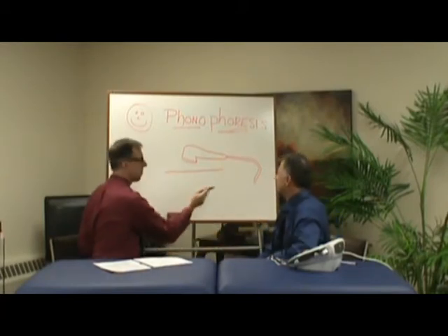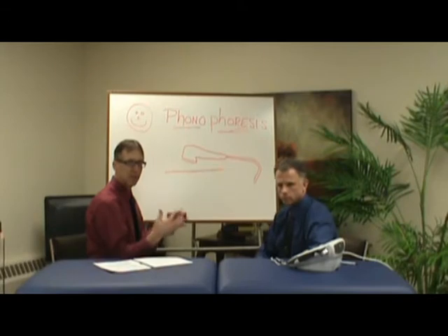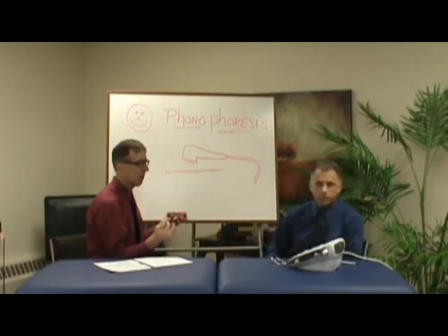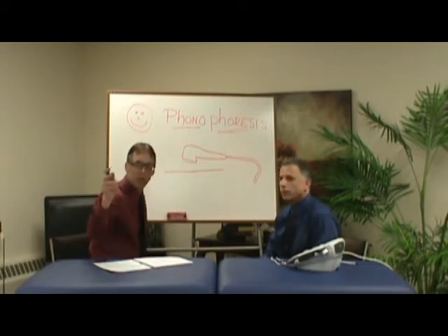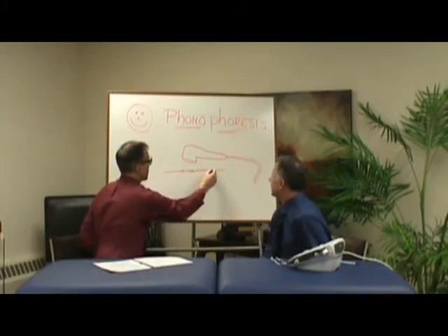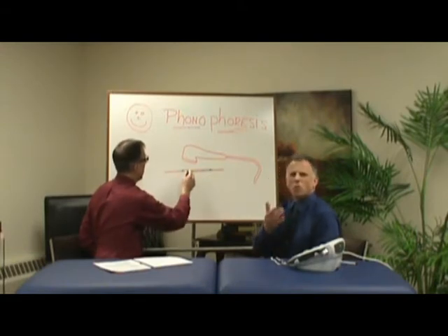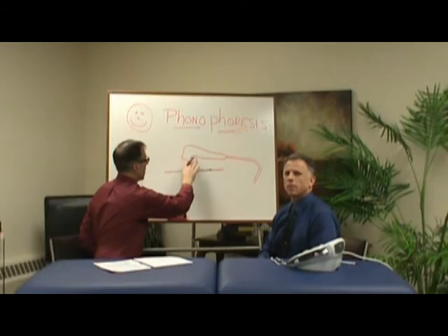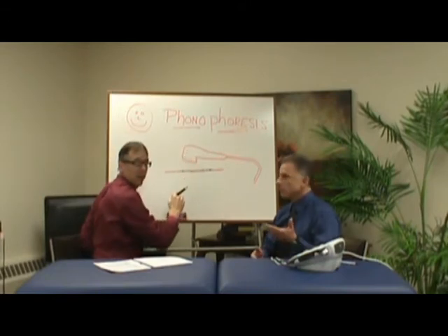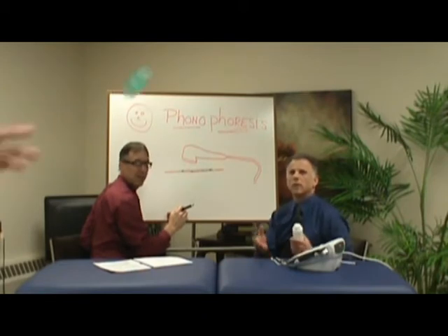So we put down a gel, which the ultrasound actually has to have in order to work. But the gel is mixed in with the type of medicine we're going to use, and there are different types of medicines we use. Anyway, so we lay down this gel on the surface of the skin. You know, this is your body or body part here. And this head then, here comes the gel. That's one of the gels.